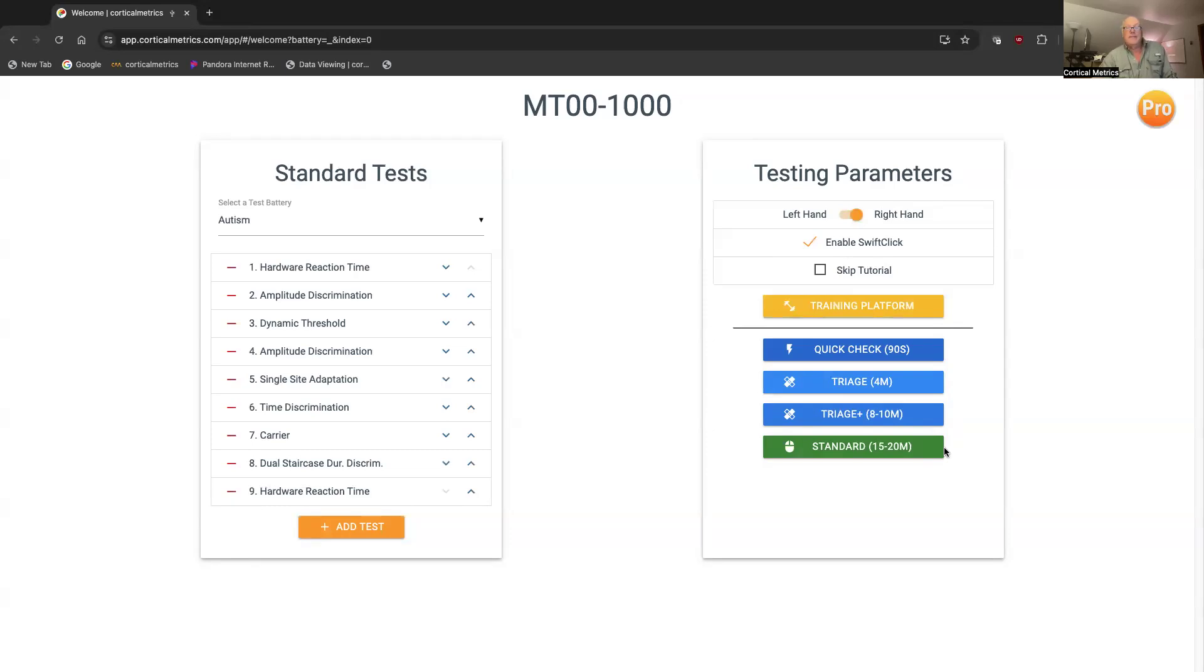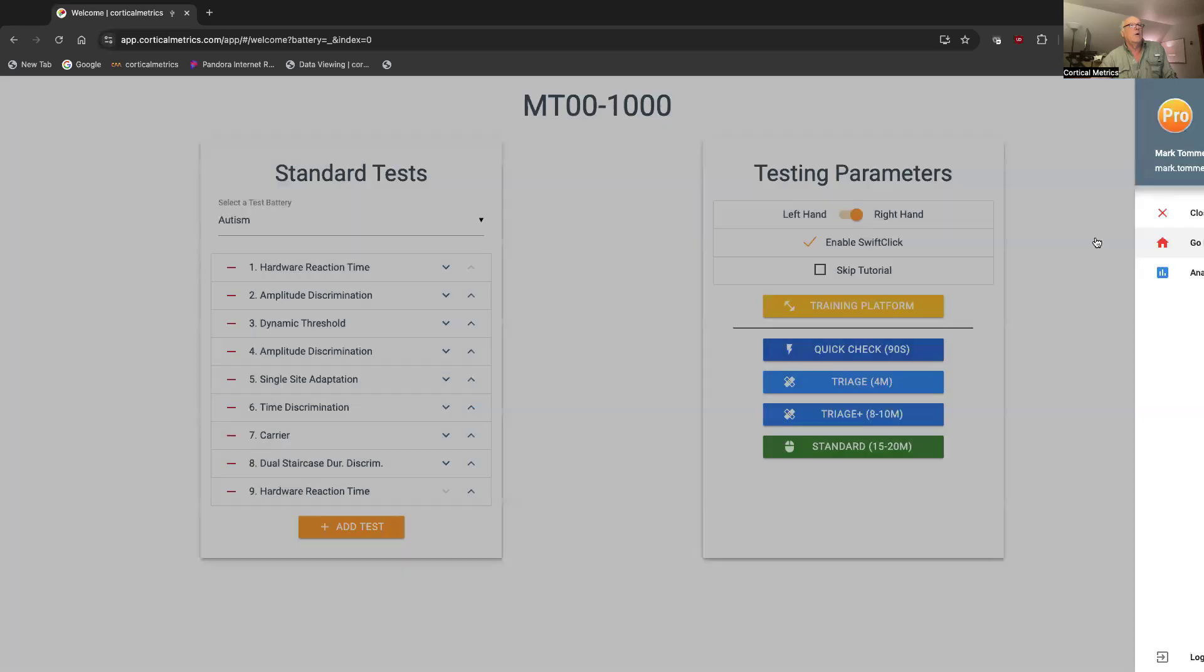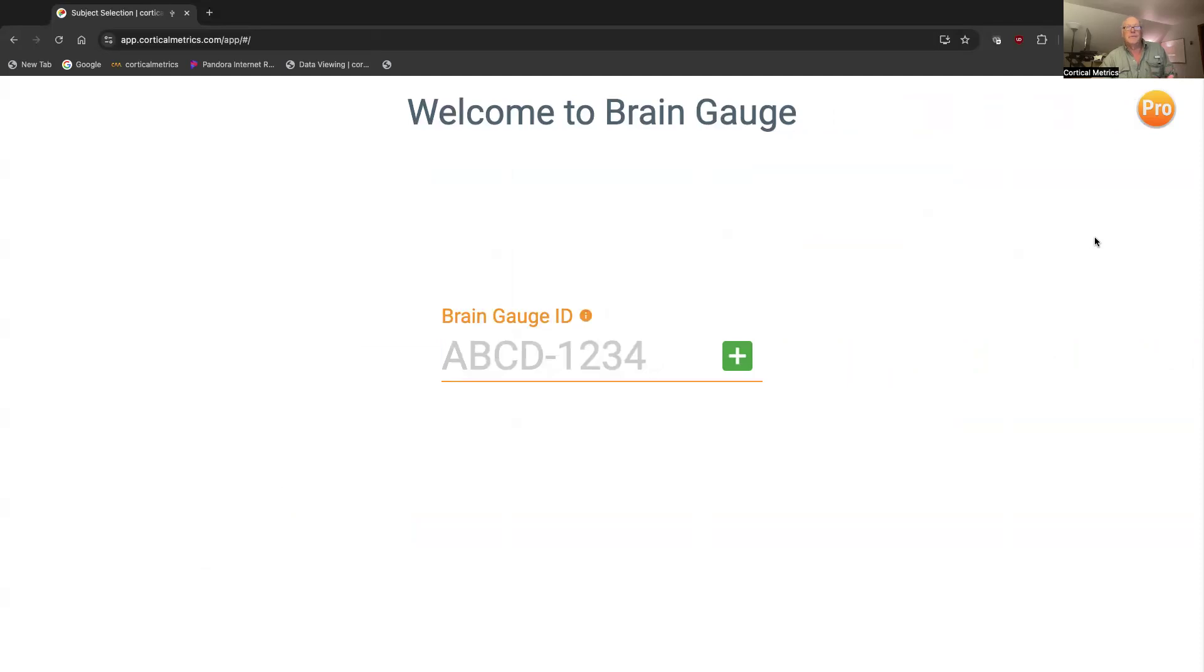Anyway, that is the way you get started on the BrainGage. And if you want to go to the next subject, we click here, we go home, and we're right back ready to do the next subject, assuming that you've done something like test.